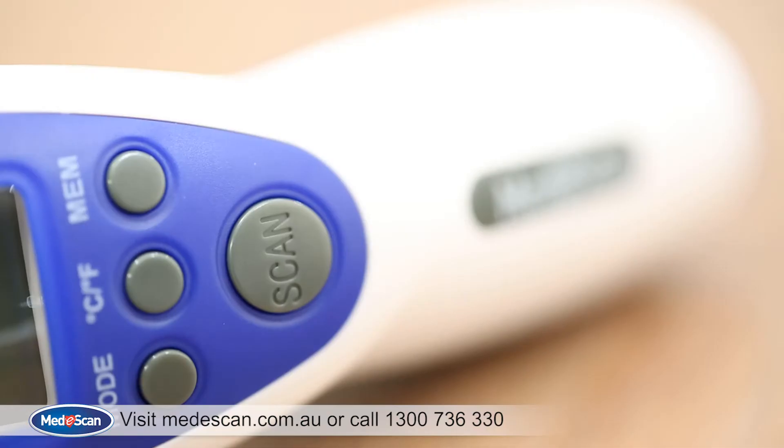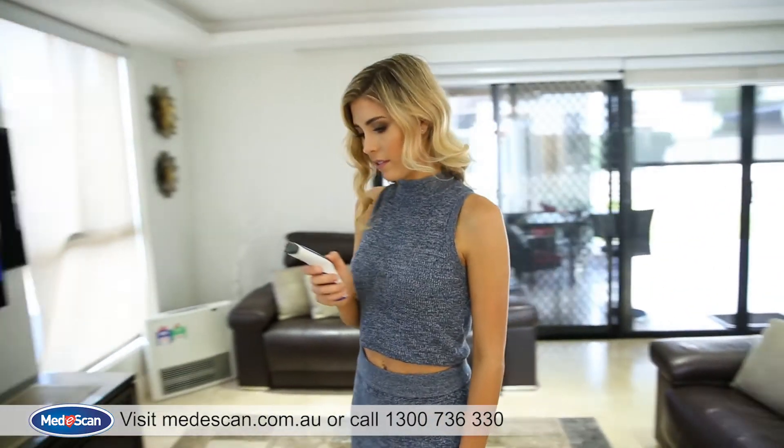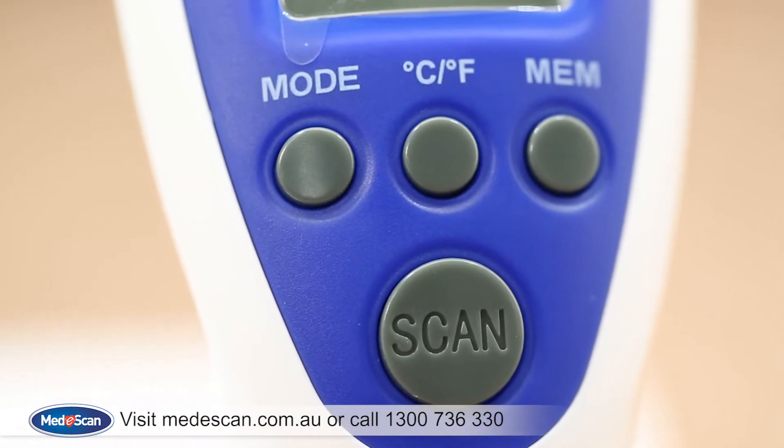The MediScan Touchless Thermometer has three different modes: surface, body, and room temperature. You can switch between the different modes by pressing the mode button.